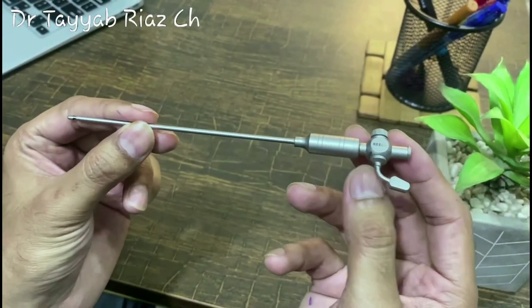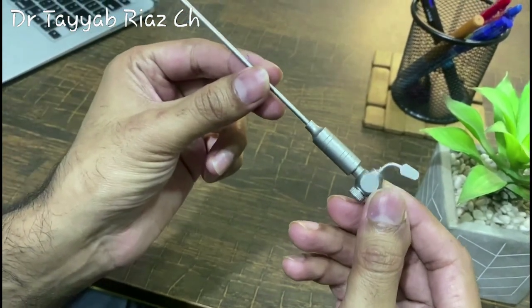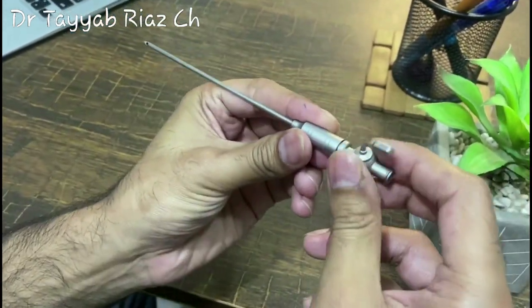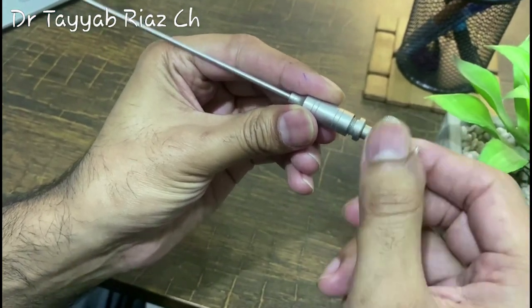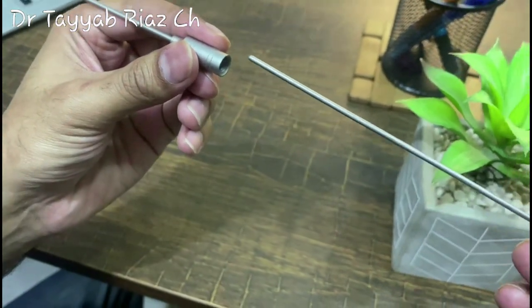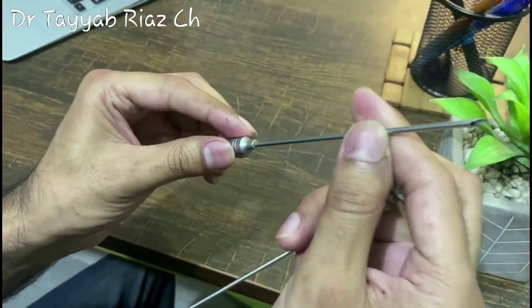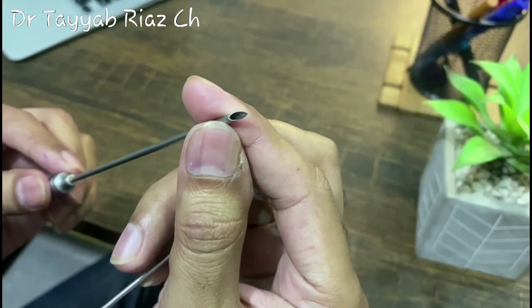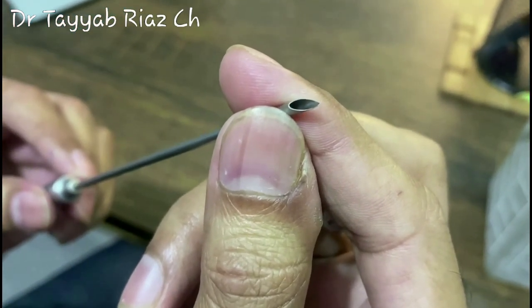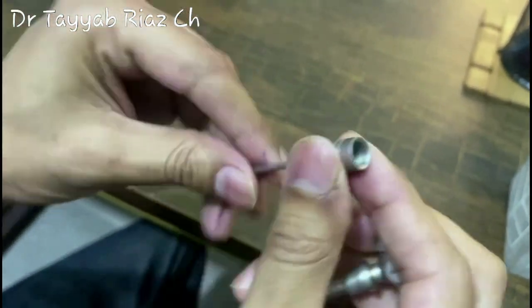The Veress needle has two main components. One is the outer needle and one is the inner stylet. We can bring out the stylet with the help of this anti-clockwise rotatory movement. And here it is completely out. This is the stylet. And this is the outer needle. It has a sharp tapered end for sharp entry into the resistant structures of the abdominal wall, like the rectus and the peritoneum, and it is hollow inside.